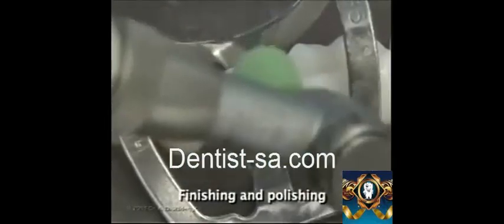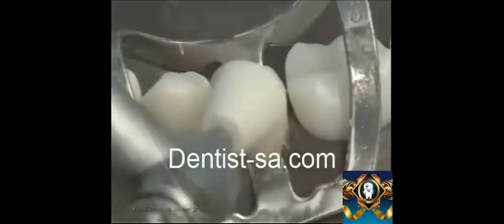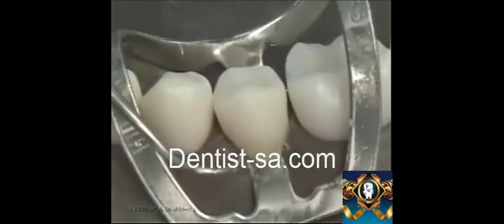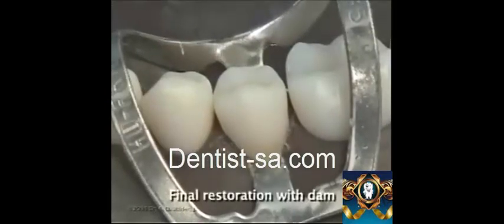The finishing and polishing procedure is done using rubber cups or rubber points of medium grits and proceeding to finer grits to impart the final smoothness and shininess to the restoration. The explorer is again used at this stage to evaluate the smoothness of the restoration. This is the final restoration with the dam in place.